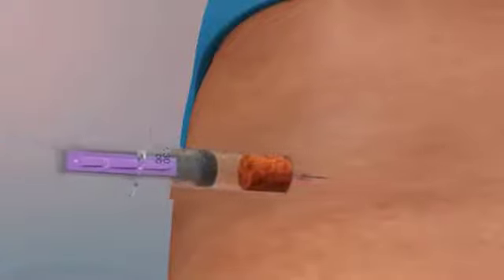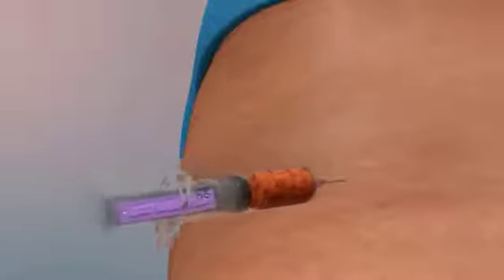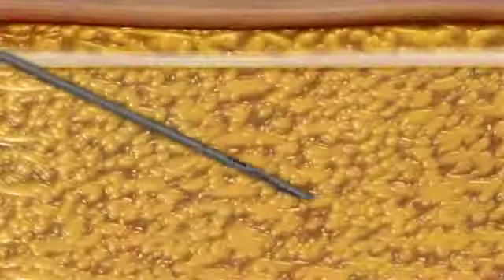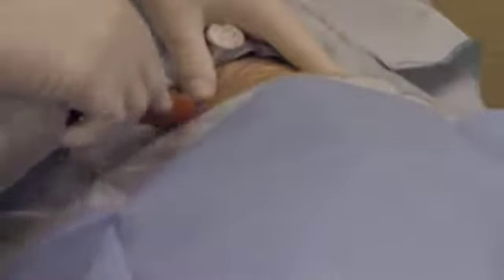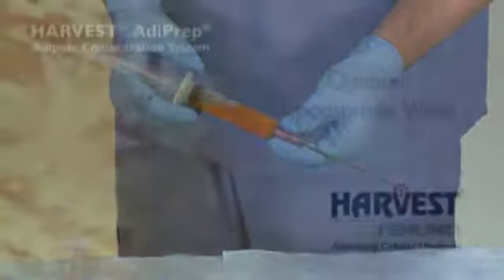Once the first collection syringe is filled, repeat as necessary with additional syringes until the desired amount of lipoaspirate is collected. It is recommended that some extra lipoaspirate be collected during the liposuction procedure to account for any excess fluid that may be present in the sample. This will maximize the amount of adipose tissue loaded into the AdiPrep process disposable.